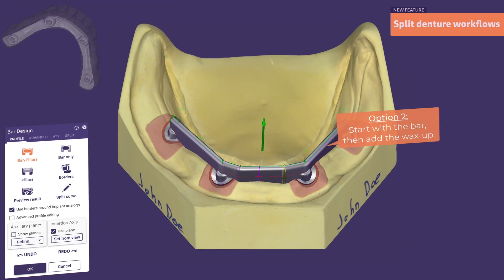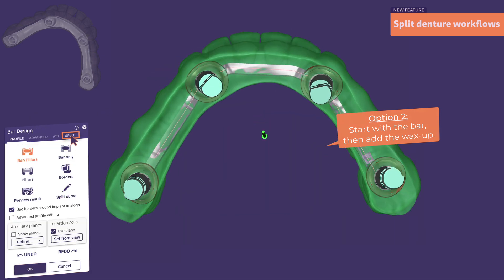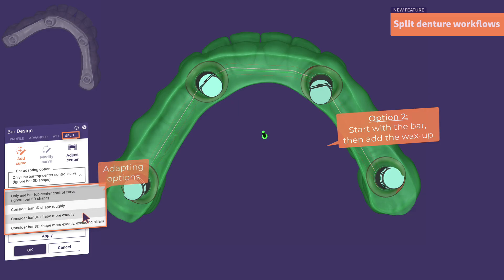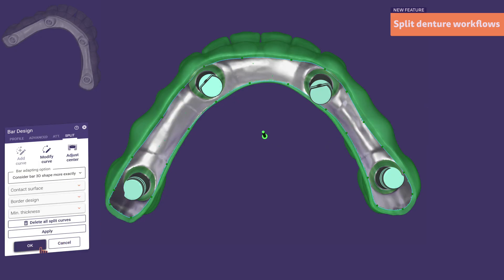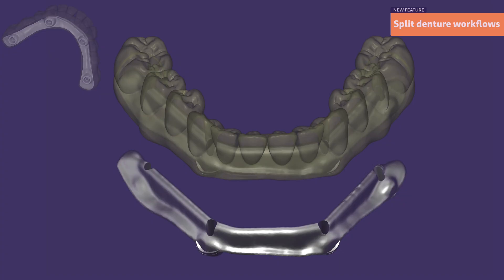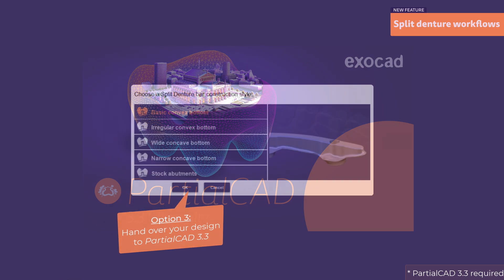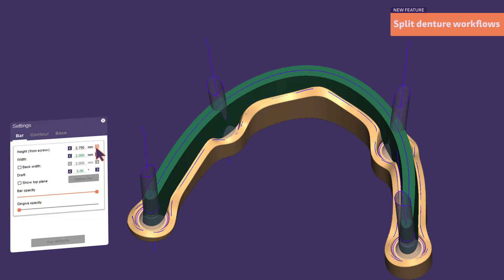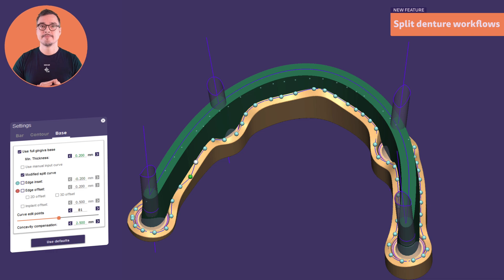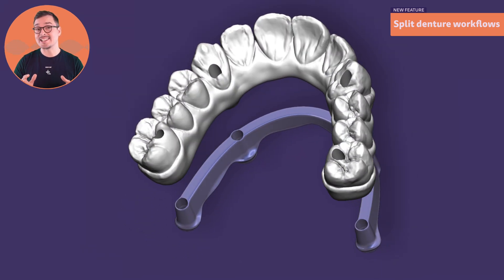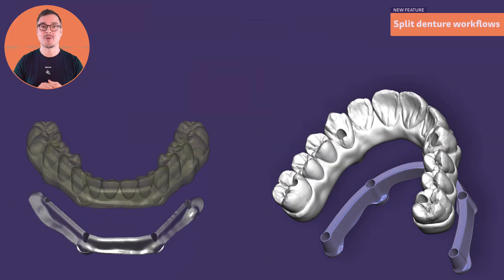You're also free to start with the bar design, where you simply add the scanned or saved reconstruction. This way lets you open the split tab and choose from multiple adaptation options to decide how your bar design and reconstruction adapt to each other. This workflow handles your project entirely in DentalCAD — no additional modules required. And for those who prefer the power of partial CAD, just hand over your design, select your preferred construction style, adjust the bar, contour and base to your needs, and apply your expertise.